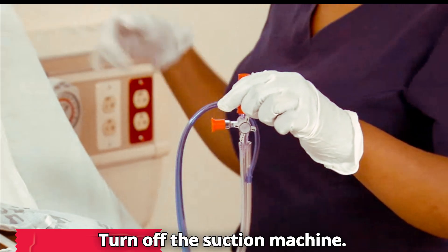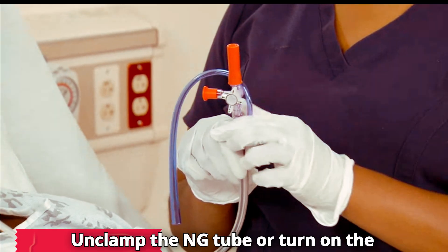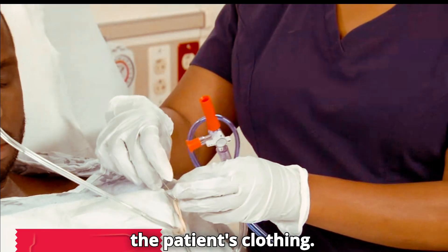Turn off the suction machine. Unclamp the NG tube or turn on the stopcock. Unpin the NG tube or remove tape from the patient's clothing.